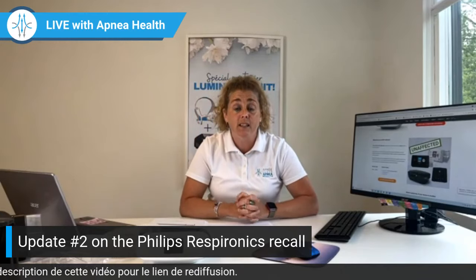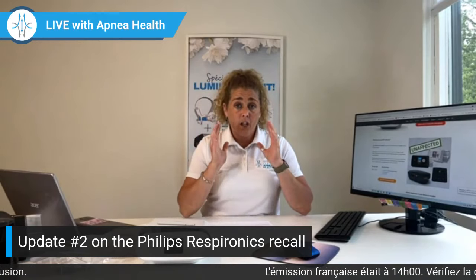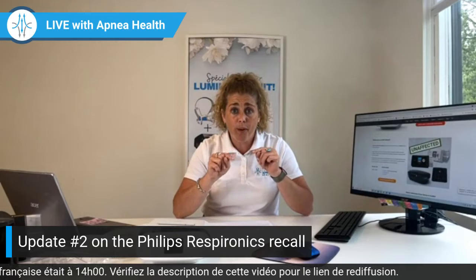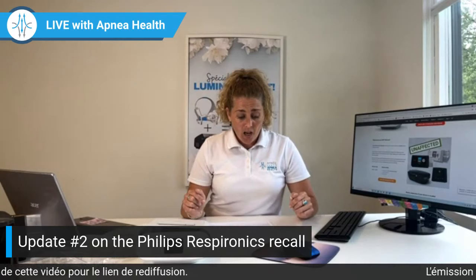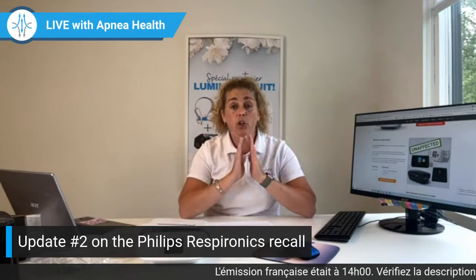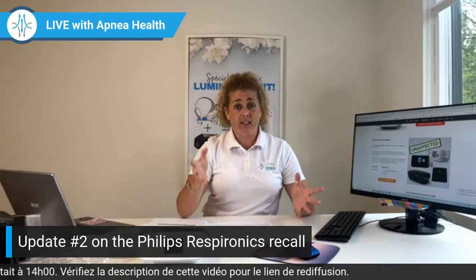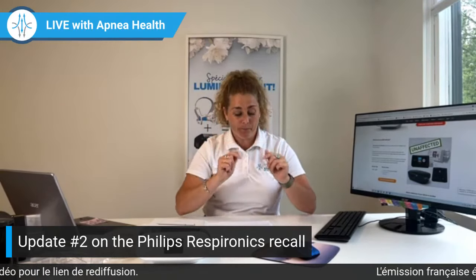It's mind-blowing, but the risks are very low, and let me explain why. First of all, the complaint rate is 0.03%. I'm just going to repeat that part because it's important. Now, up to date, there have been no reported serious side effects, hospitalizations, or deaths about this recall. So that's information you need to keep in mind.